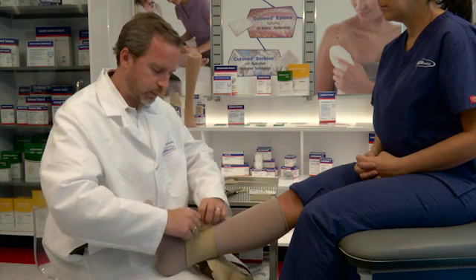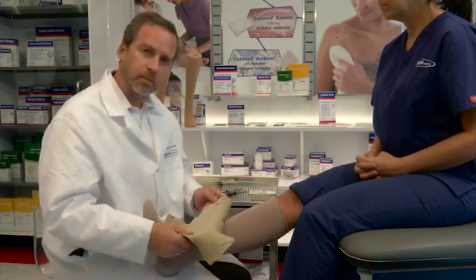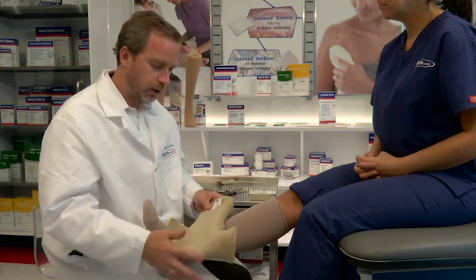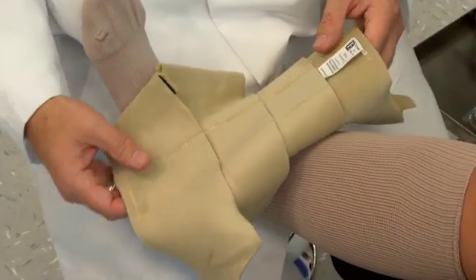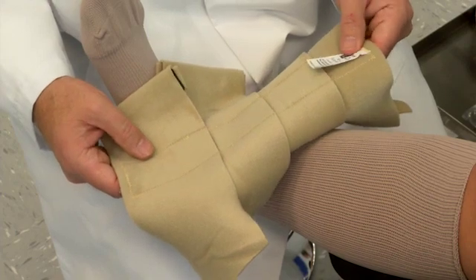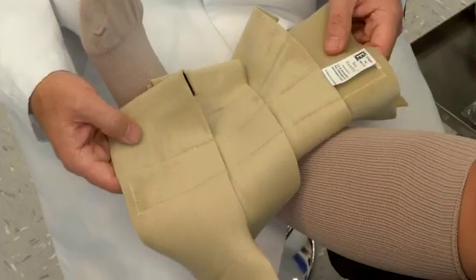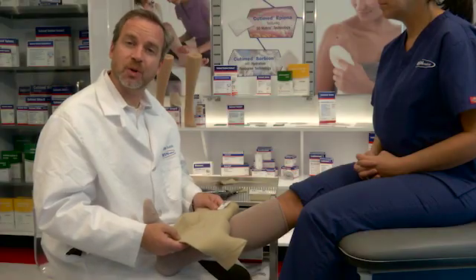Another feature of the Farrah Wrap that is probably not emphasized much is that you could actually stock a Farrah Wrap medium and extra large in your clinic, trim them down to size, and basically replace all the sizes of the Farrah Wrap easily using only two sizes. This is a unique feature because the fabric is trimmable. Thank you very much for watching the video.